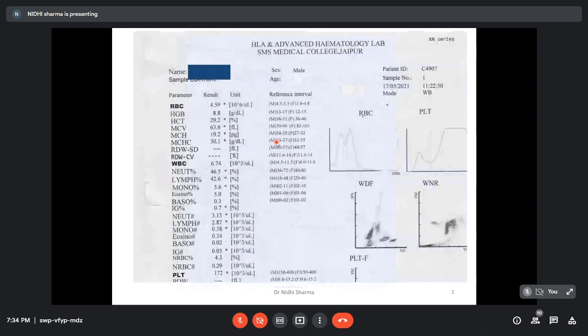It's the same report, but now we have the histogram here with us. So what is this histogram telling you? It is telling you that there are two kinds of population, and the mean of which came to something around a microcytic number, and you just thought of it as a plain iron deficiency anemia and treated only that part. But he might also have another population, which could be a megaloblastic anemia or a sideroblastic anemia that we are dealing with. And because we have not tried to treat that part of his anemia, he has failed to show the desired kind of response.